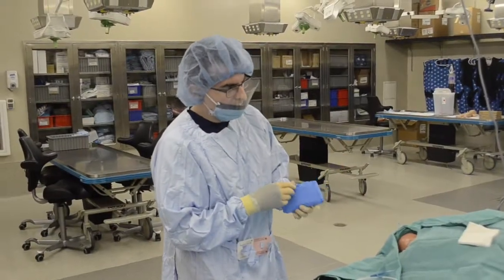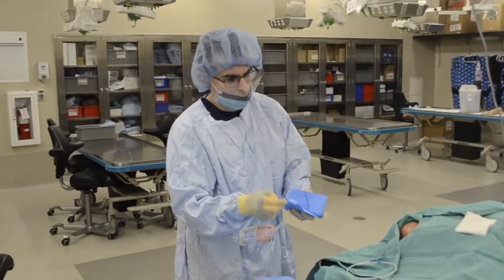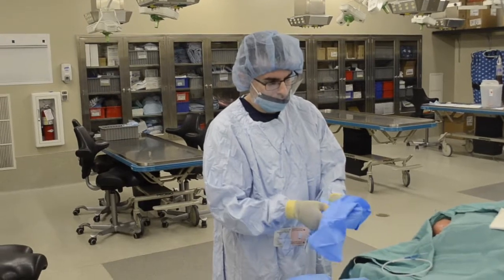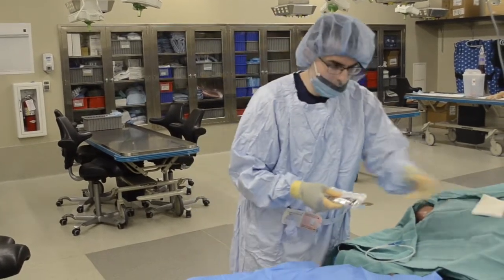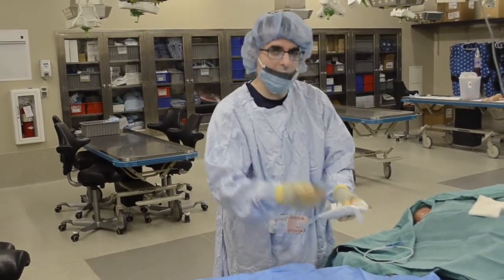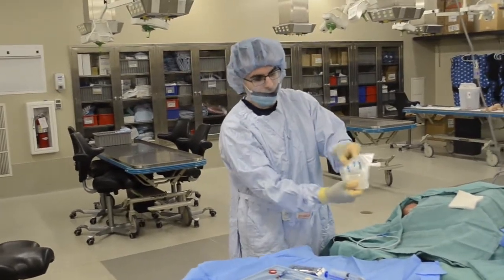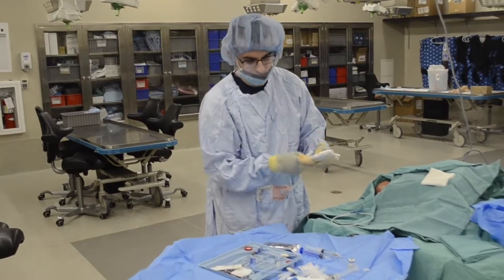So the next thing we're going to do is put on the probe cover. So we're going to open this up. Set that aside. And inside you'll find some sterile gel. And you'll find a plastic probe cover.